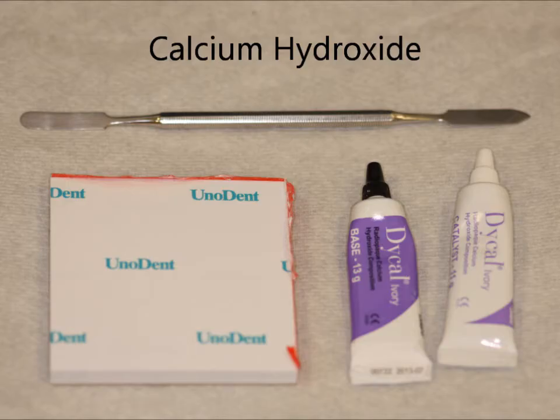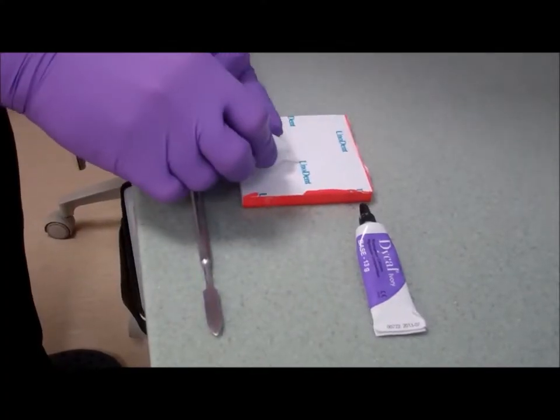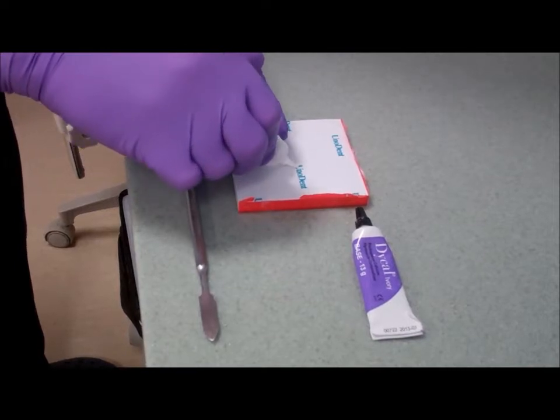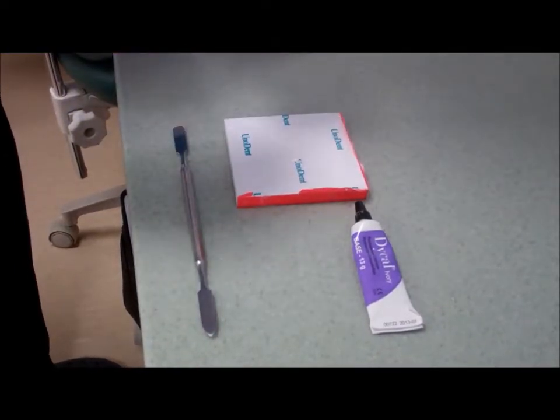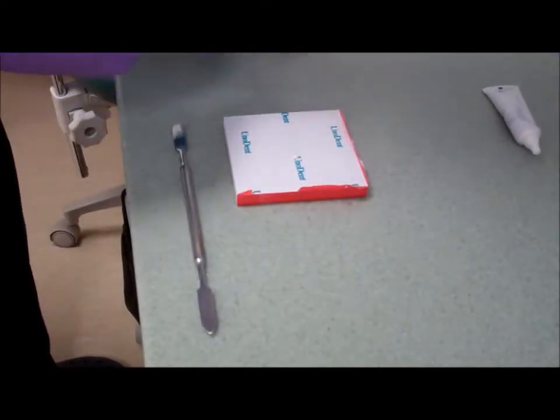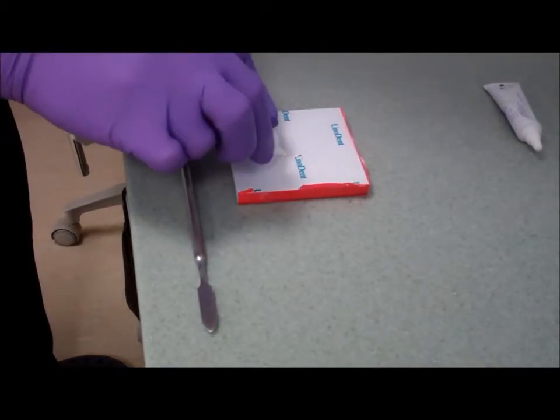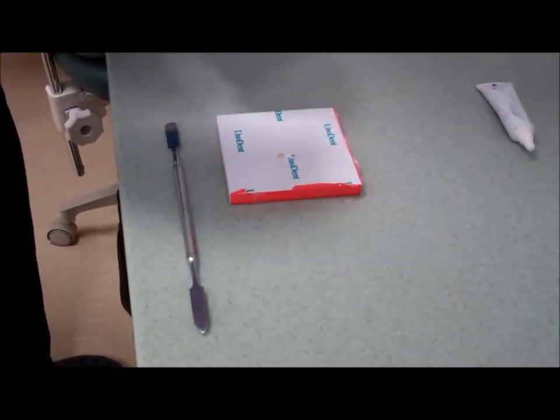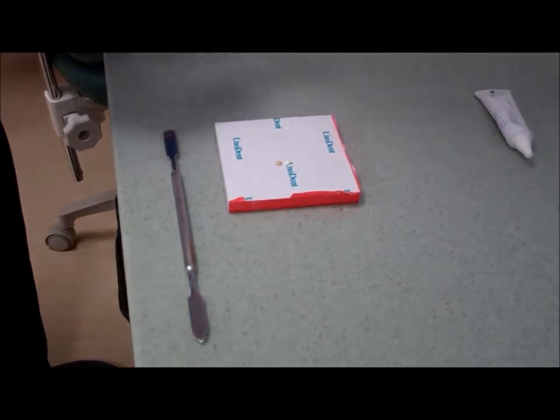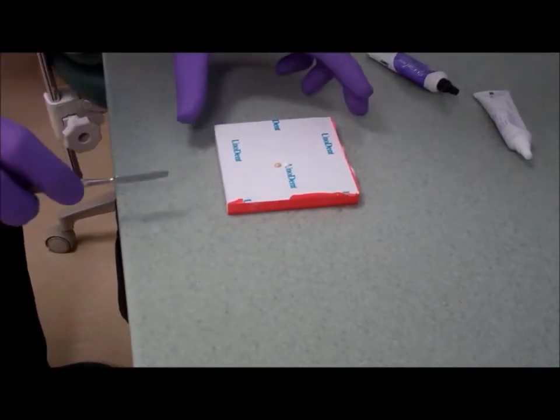Calcium hydroxide is a lining material used for direct and indirect pulp capping. It comes in two tubes, a base and a catalyst. Take a small amount of each, equal amounts from the tube. They're different colors, and then you can just use your spatula to mix them together on the paper pad until they're an even color.